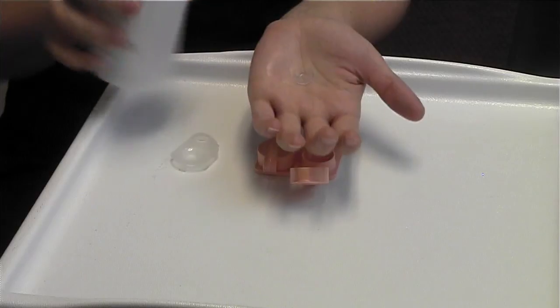Every time you take your contacts out, it's important to clean them. So when you take the lens out of your eye, you're going to put it in the palm of your hand.